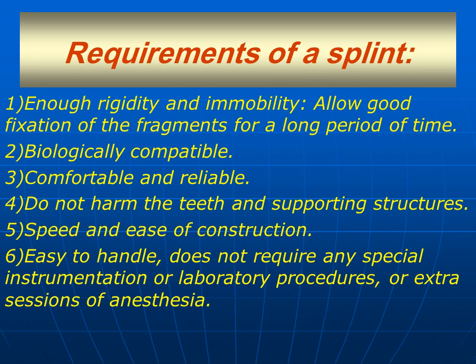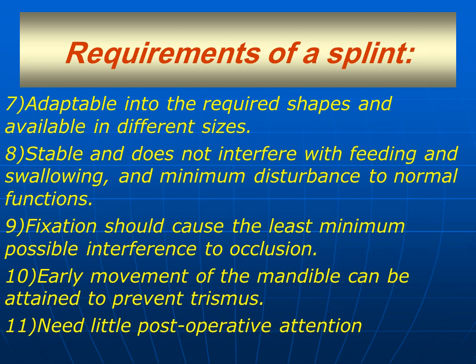It should be very easy to construct, so speed and easy production is very important. Also, easy to handle and does not require any special instrumentation or laboratory procedure or extra session of anesthesia to place the stent. Adaptable into required shapes and available in different sizes. Stable and does not interfere with feeding, swallowing, as well as minimum disturbance to normal functions.